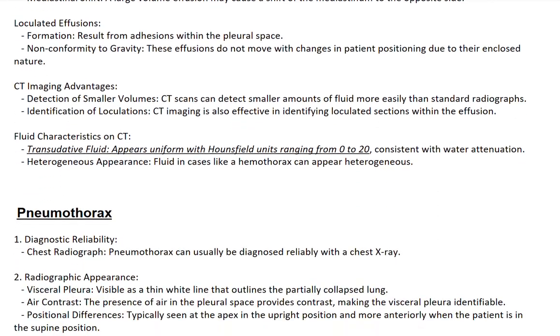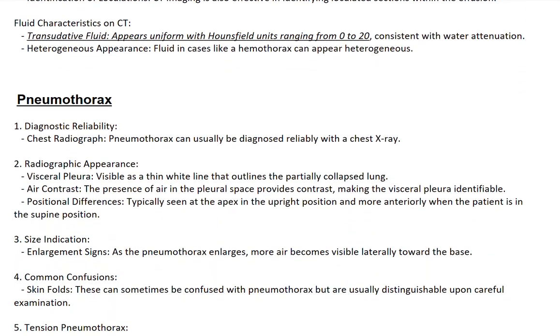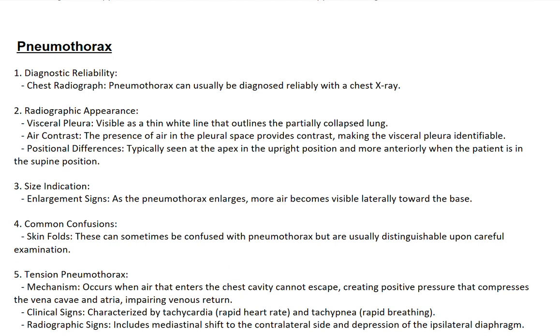This concise summary outlines the key diagnostic features and imaging strategies for identifying and understanding pleural effusion, highlighting the importance of both conventional radiography and CT imaging in different scenarios.